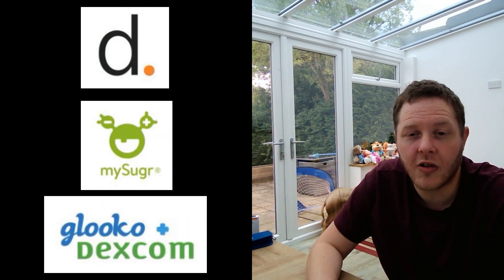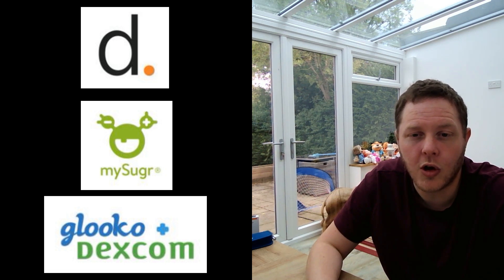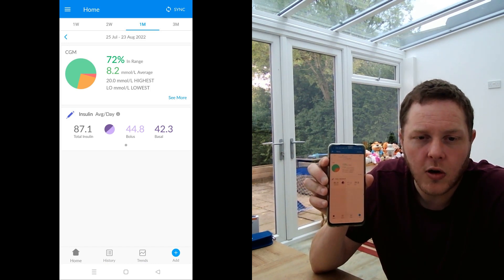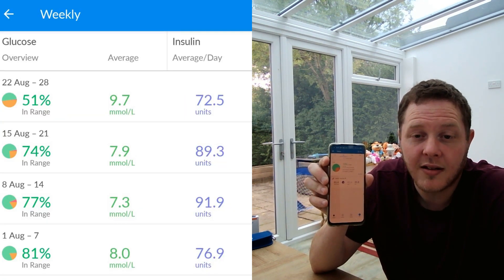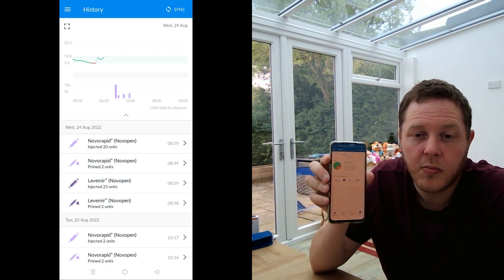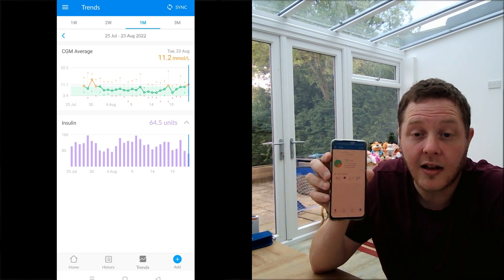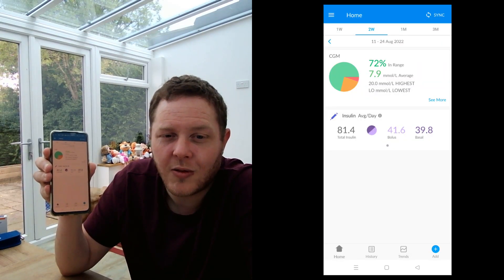There are many different apps you can use to synchronize your data from your smart pens, including mySugr, and also Gluco. I use the Gluco app on my phone and it links up with my CGM, so I can see my average readings there, and by uploading data from my smart pens I can also see how much insulin I'm using on average.